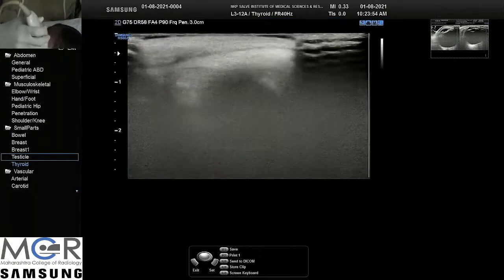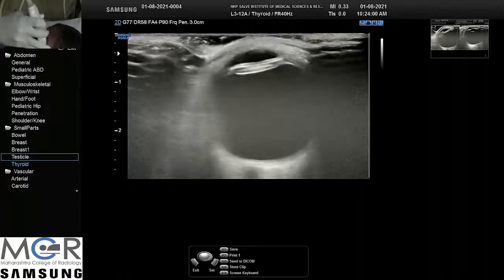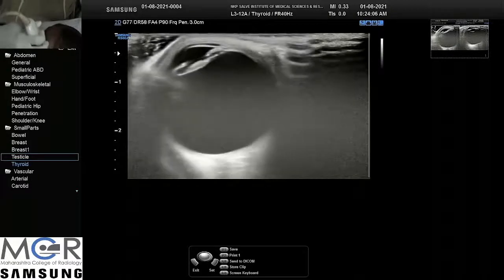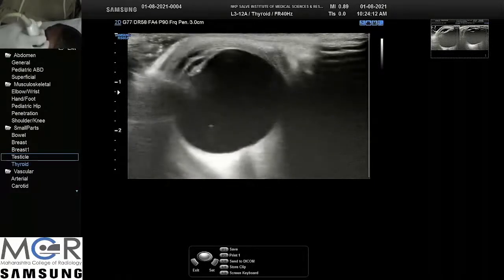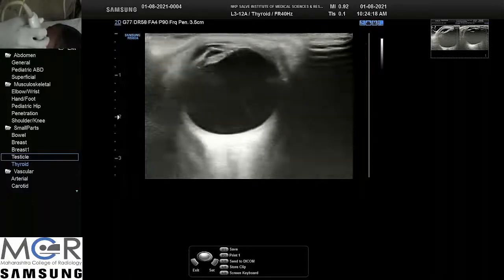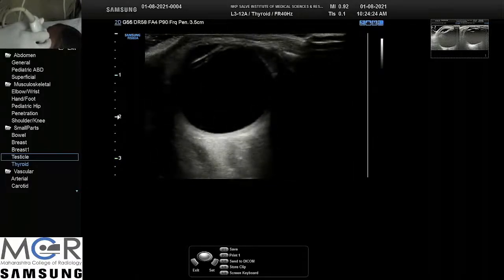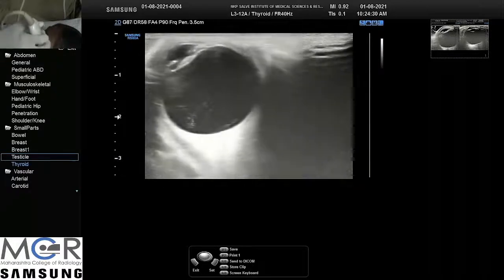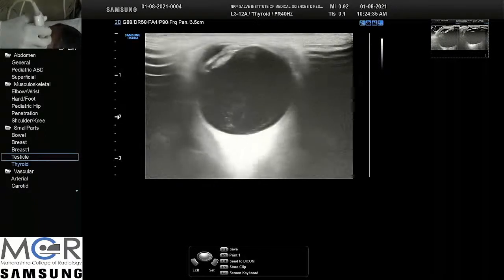They have done some procedure there? No. Okay, we'll try to see the foreign body, as she has a history that some wooden object has hit the eyeball. We'll go to the posterior chamber. Is there any abnormality within the globe? Increase the depth, reduce the gain to see the walls and optic nerve, retroorbital region. Again increase the gain to see what is there in the posterior segment.